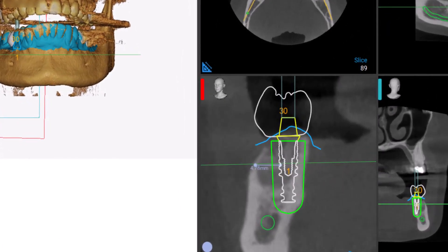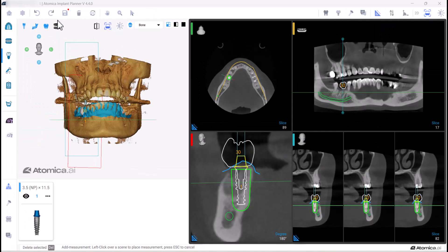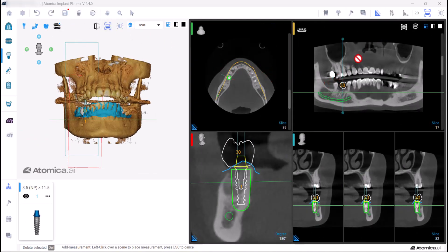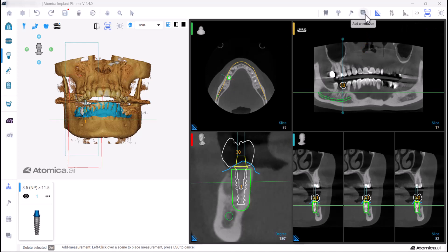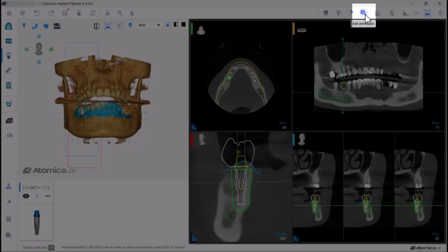The distance between the two points will be measured and shown beside the line. You can also add comments using the annotations tool.